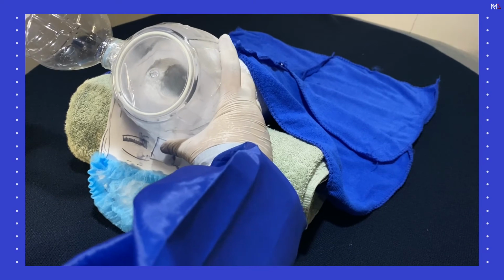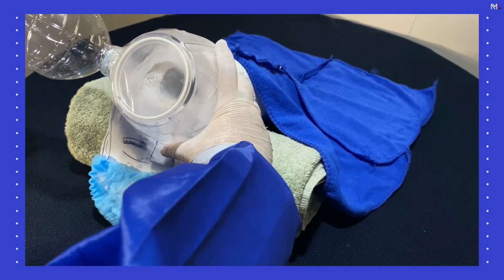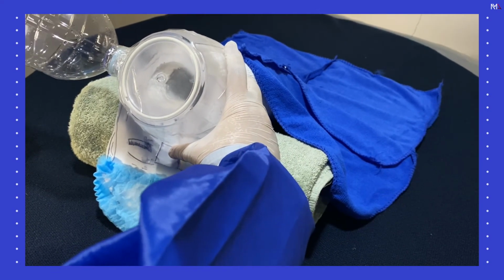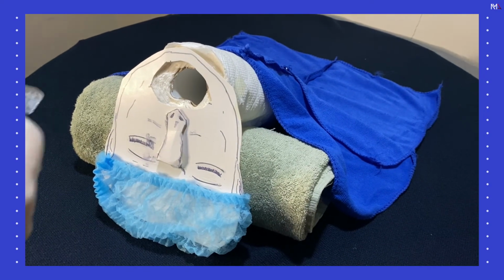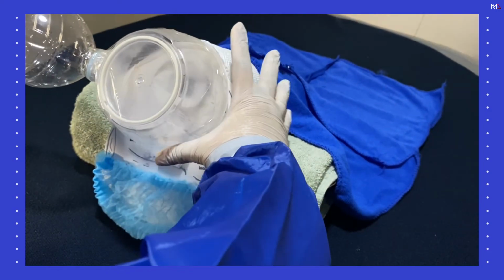To tightly seal the mask, use the EC clamp, wherein the thumb and index finger form a letter C around the mask, applying downward pressure, and the remaining 3 fingers form a letter E on the jaw of the patient for upward displacement of the mandible. An oropharyngeal airway may be inserted if chest rise is not observed, then the bag valve mask is attached again.